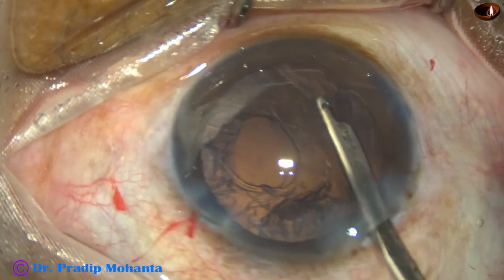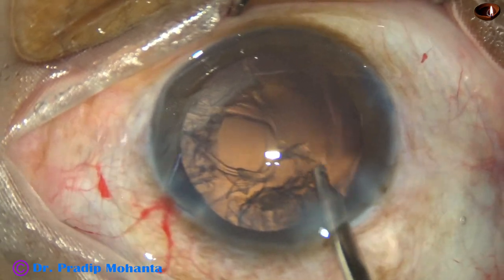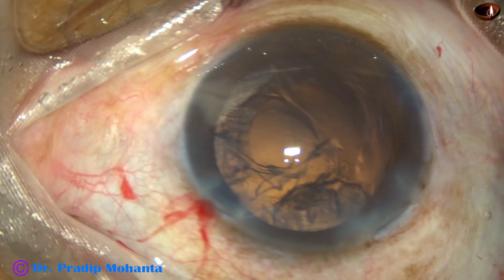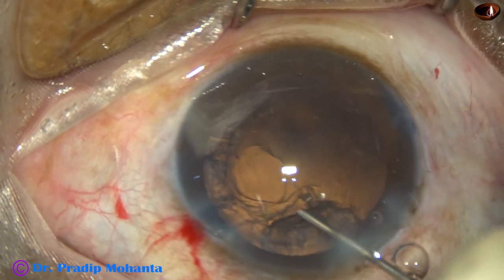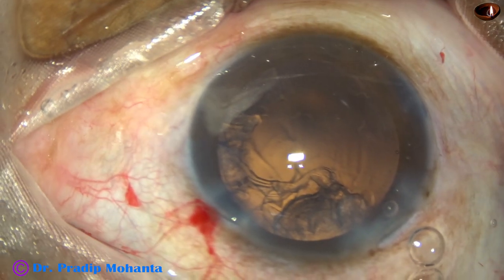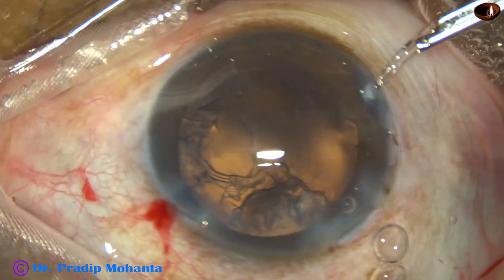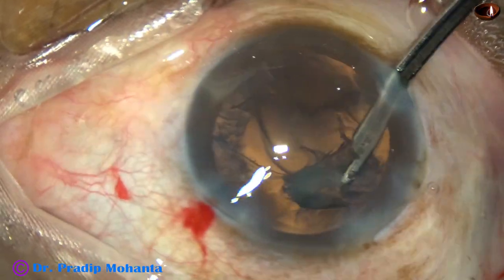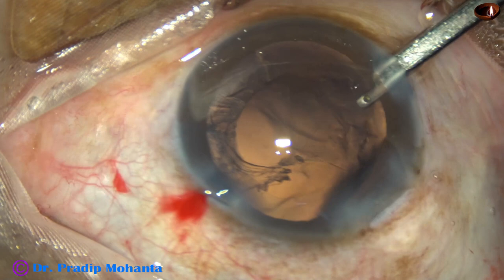I inject Viscoat again, and now I use the Simcoe cannula — 23G Simcoe — to remove the cortex from six o'clock and seven o'clock. It is nicely removed. I use Viscoat again to keep the vitreous strands at bay, then go through the right side port with the 23G Simcoe and remove the thick cortex and epinucleus from the sub-incisional area.